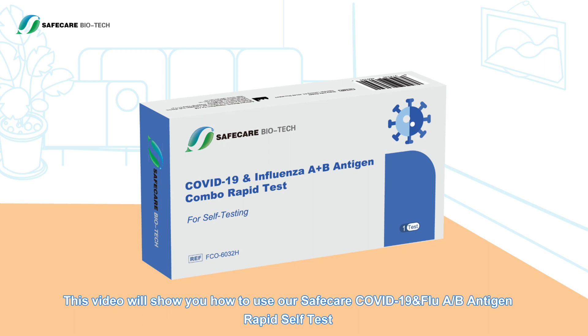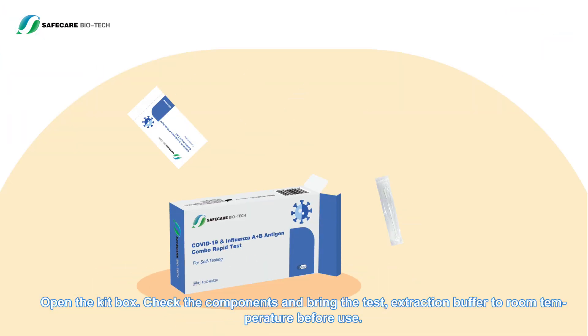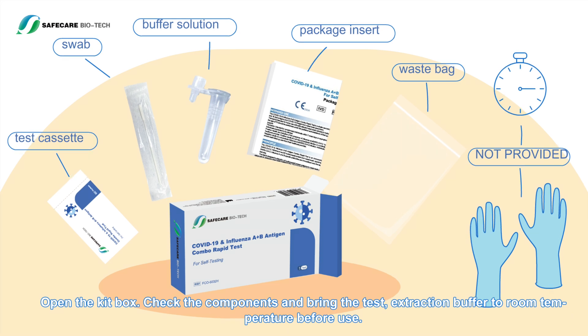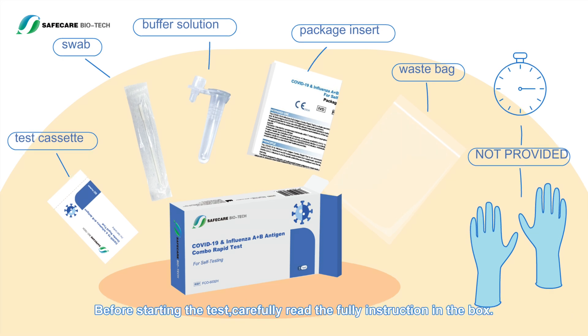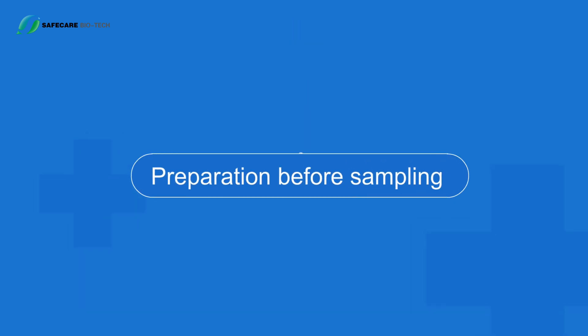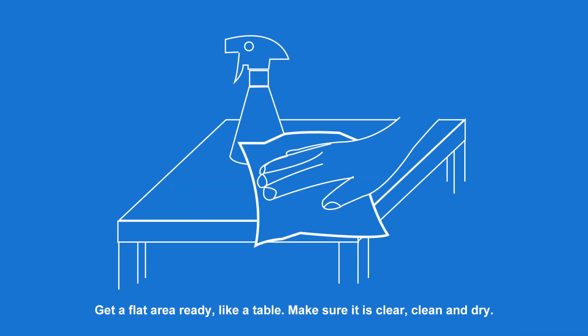Open the kit box, check the components, and bring the test extraction buffer to room temperature before use. Before starting the test, carefully read the full instructions included in the box.